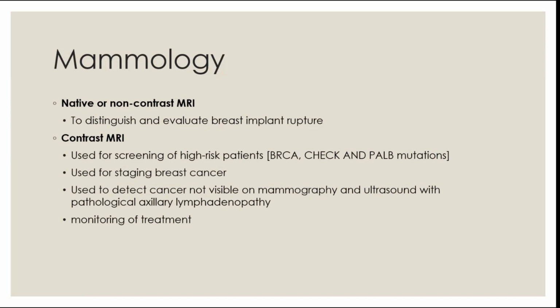We can also use MRI for evaluation of the breast. With a native or non-contrast MRI, you can evaluate any breast implant rupture, but with a contrast MRI, you can use it to screen high-risk patients, for example, with the BRCA mutations, to stage breast cancer, to monitor the effectiveness of the treatment, and you can use it to detect cancer.